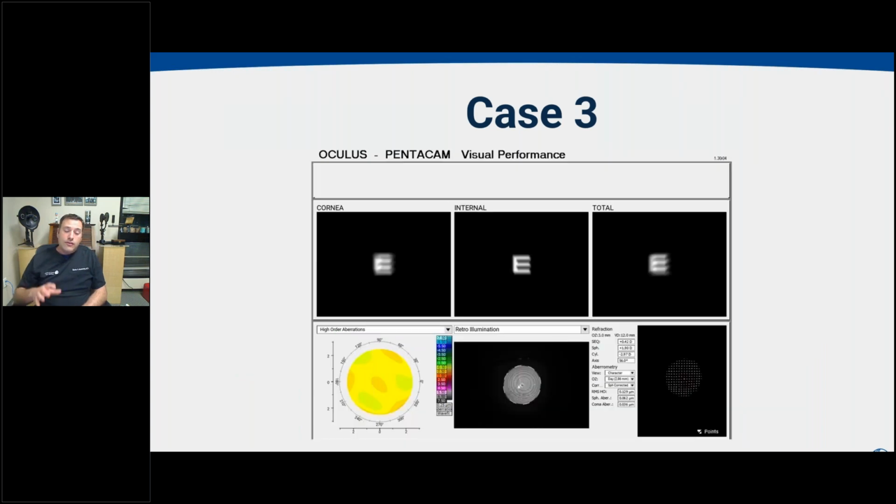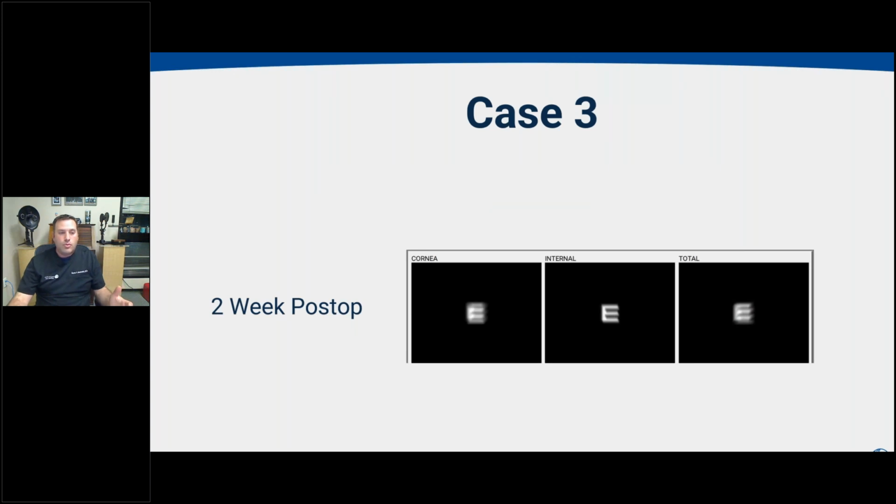So even if you could see that and do that clinically without all of the different measurements and the simulations for yourself, it does give some confidence as the clinician that you are definitely focusing on the right area of the problem. And it allows you to teach your patients what is going on here. If you take the visual performance and show them, well, your lens looks good, there really isn't much aberration there, but your cornea really is where you're getting a lot of blurriness.